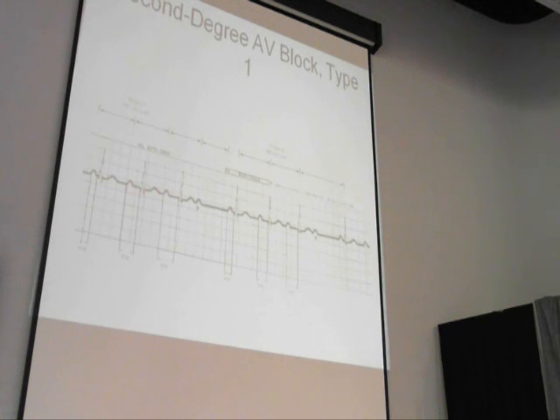Again, not anything I'm going to get real stirred up about. Yes, I'm going to look for labs. Yes, I'm going to look for meds. But again, this usually doesn't jump into a complete heart block.